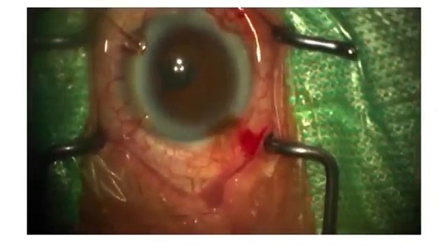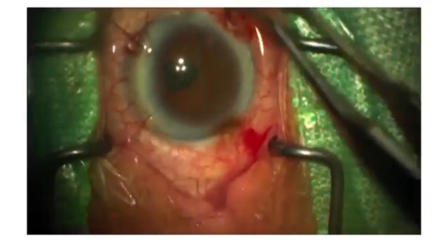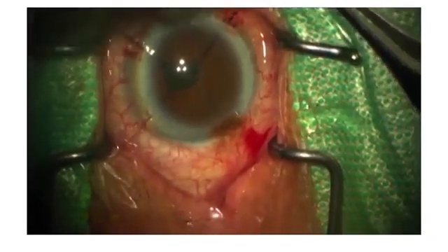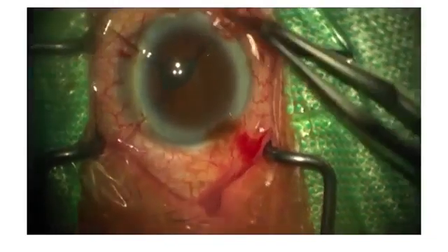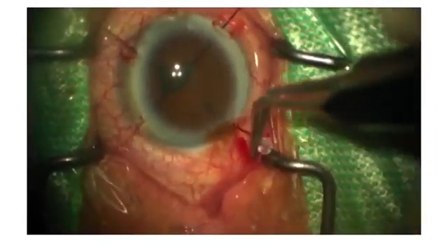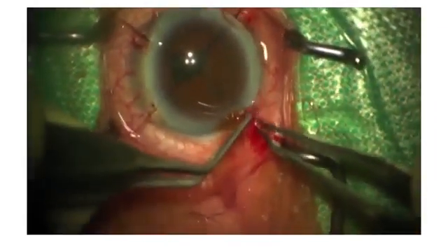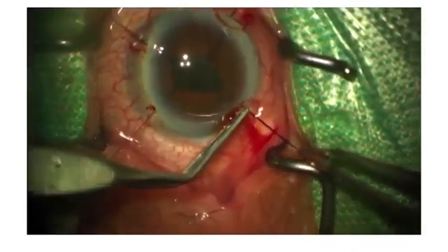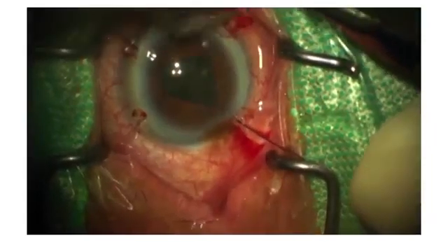A little tip that helps us is when you put the hooks in, don't tighten the hook right away. When you put the first or the second hook in, you put them in all together, and you slightly adjust the hooks. That way, it's going to be much easier to put the second, third, or fourth hook in and limit the trauma to the pupillary margin.